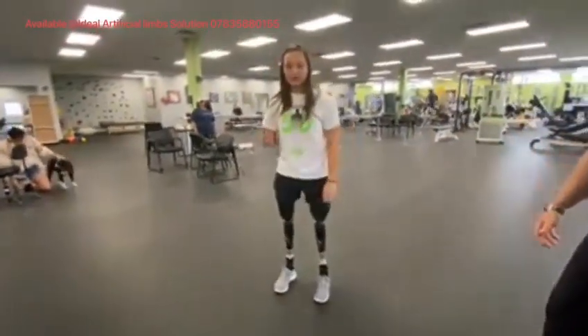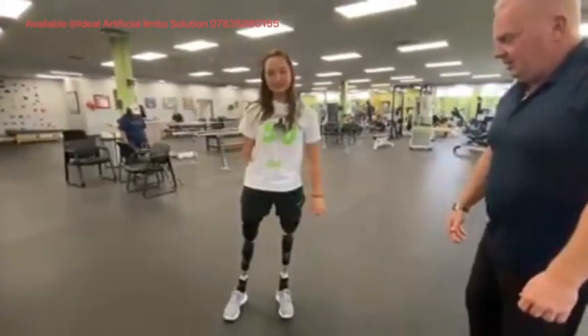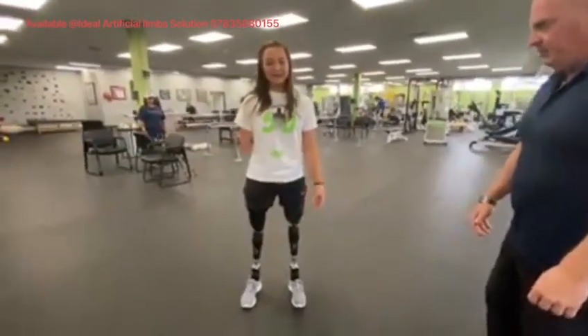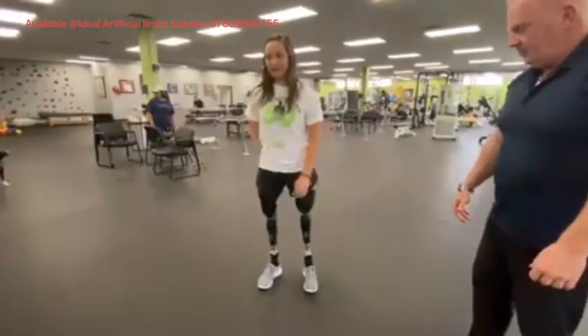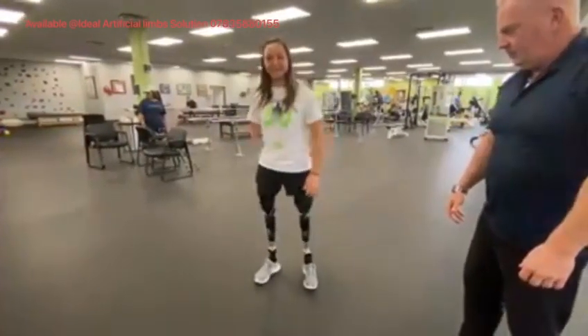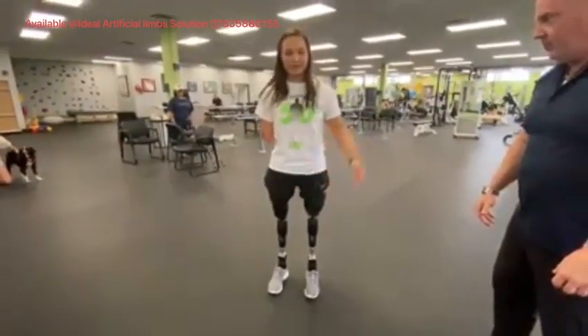It allows me to walk further distances because I'm able to actually utilize my muscles. My muscles don't get tired because I'm actually able to use them. When I'm walking, I feel like I'm almost on a running blade — like I'm getting pushed forward, so I'm able to have more energy.